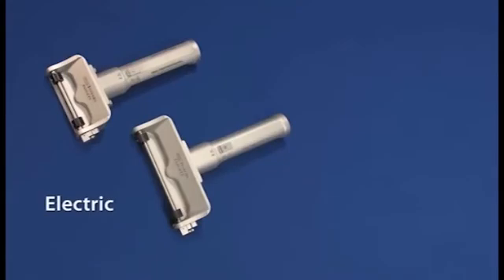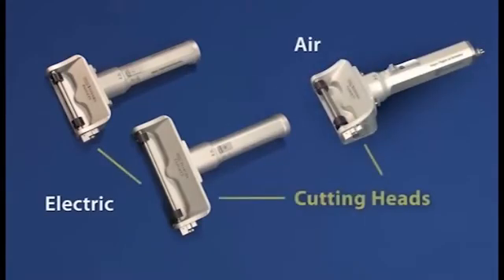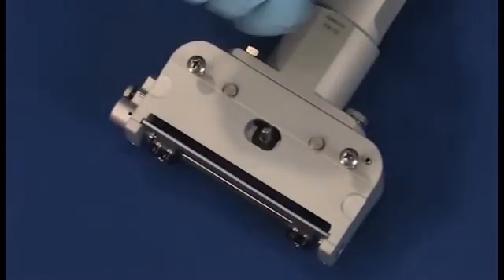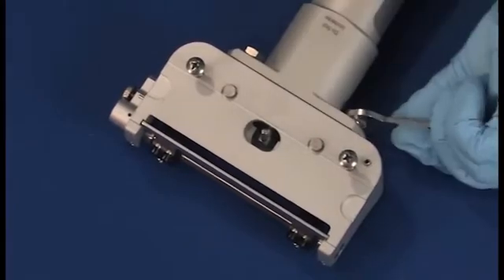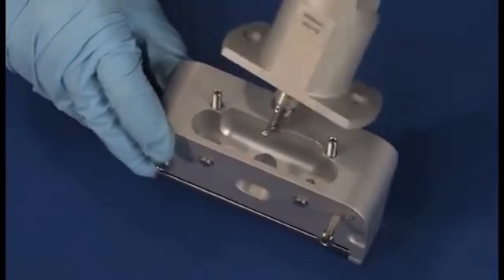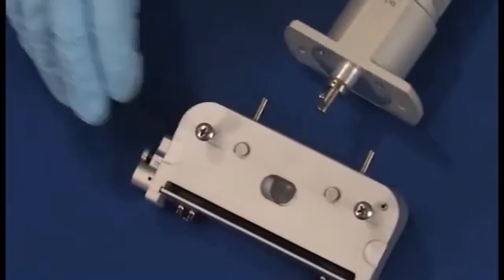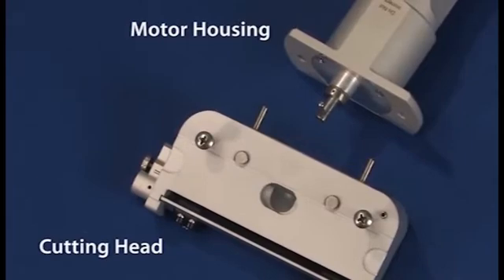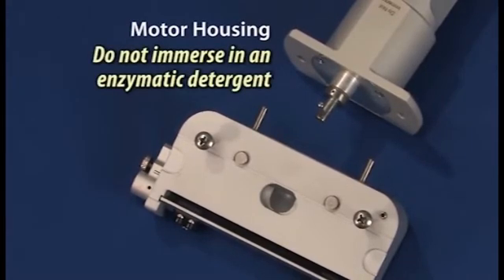The Model S, Model S6, and Model C dermatomes also feature a unique removable cutting head to allow for more thorough cleaning. The cutting head can be removed from the motor housing by loosening the nuts on the back of the head, then simply pull the head off. This allows the cutting head to be fully immersed in an enzymatic detergent. The motor housing should be scrubbed and rinsed, but do not immerse the motor housing in an enzymatic detergent.